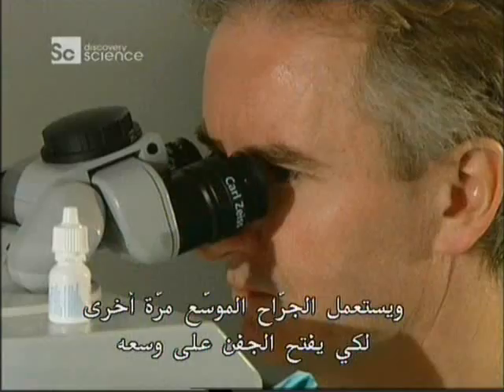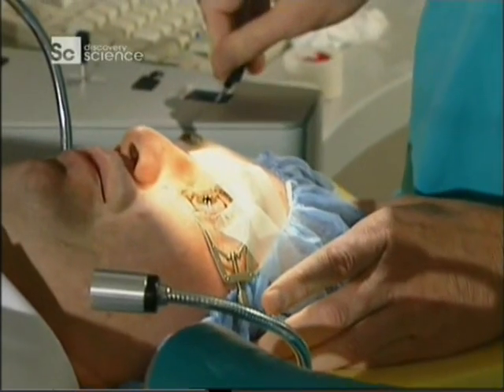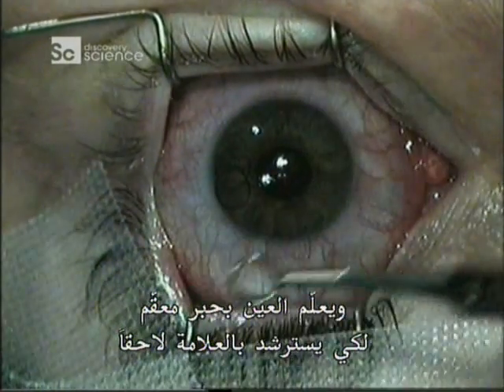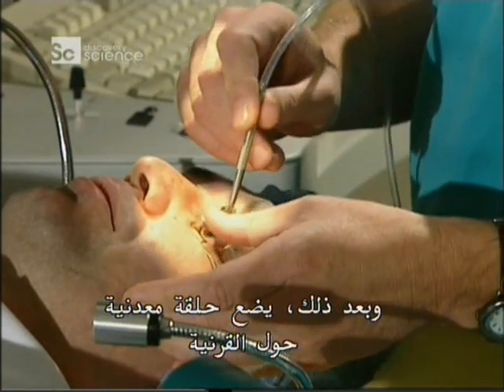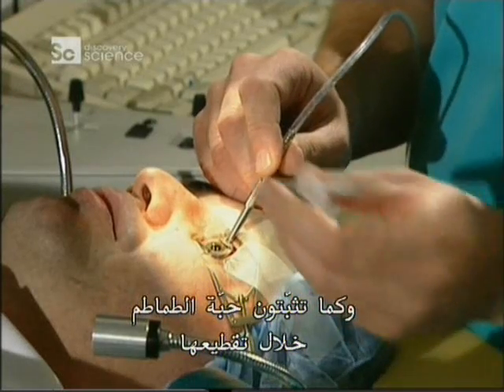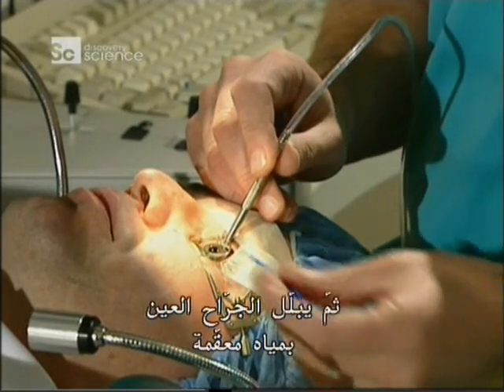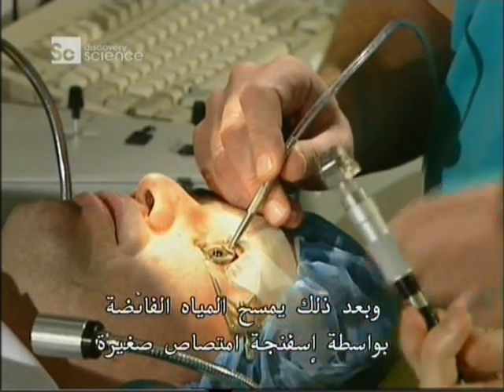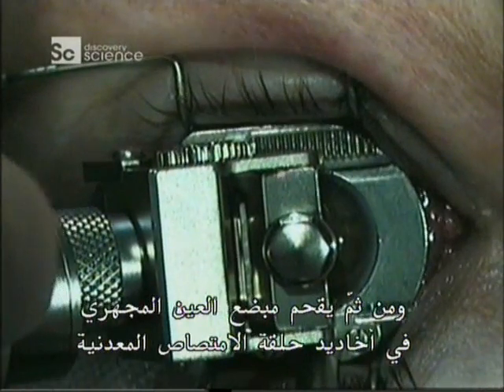The surgeon uses the speculum again to prop the lid open, then begins the operation. The eye is marked with a sterile ink as reference marks to be used later. Next, a metal ring is positioned around the cornea and attached to a suction pump so it clings to the eye — like holding a tomato steady while you slice it, it holds the eye still while the surgeon cuts the tissue. The surgeon lubricates the eye with sterile water and mops up the excess with a small absorbent sponge. Then the microkeratome is slipped into the grooves in the metal suction ring.